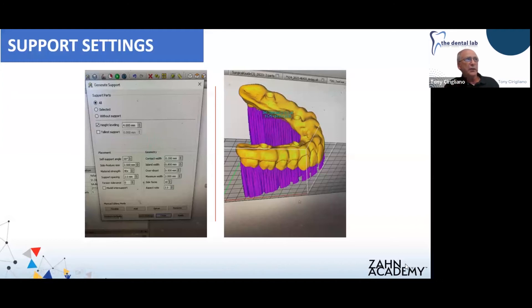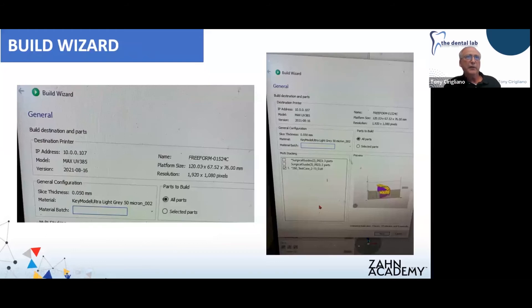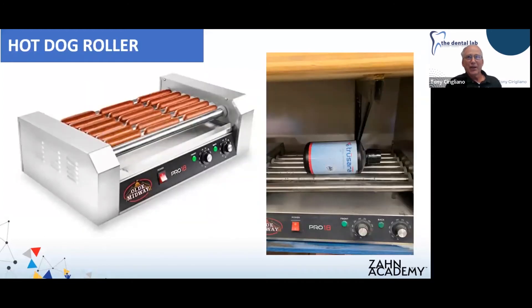A lot of the settings you see here are generated automatically by the software, and you may have to tweak a couple as you go. I would communicate with Asiga and get them to help if you feel you're not getting the results you should be. We forgot to update the material usage on here — we did not use ultra gray model material to print this case. That was just an old setting. We use the hot dog roller because Trusana has a pigmentation added to achieve the proper shade, and it's highly recommended to mix the Trusana material very well prior to printing.